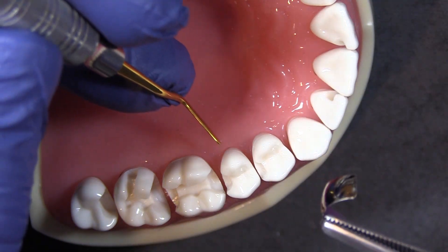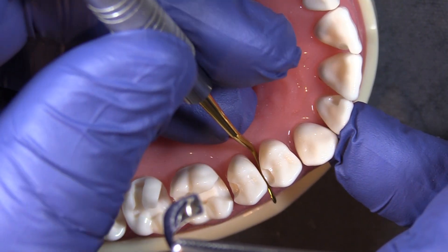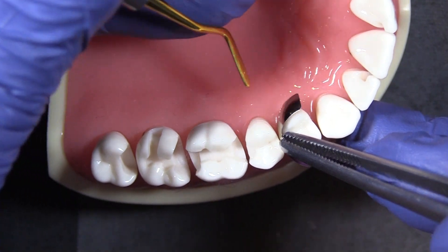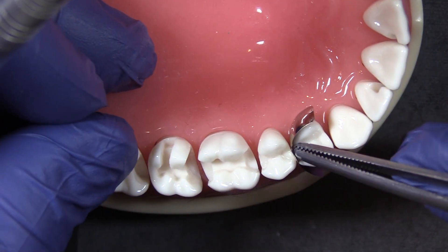Tip number three: here I'm going to insert a firm bladed composite instrument and apply a little torquing pressure — open that up, slide the band in place, remove the instrument. This does take two people: one to apply the torque, one to slide the band in.